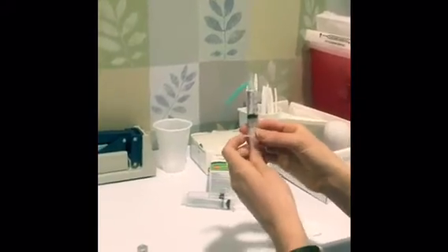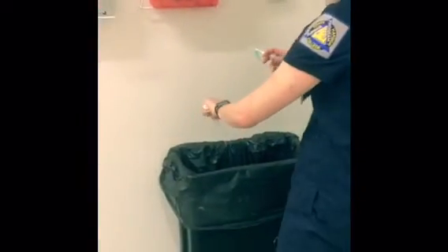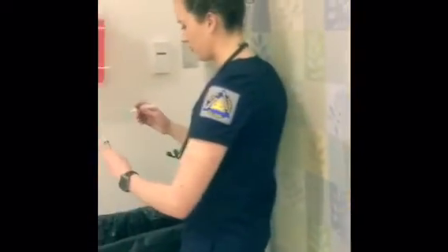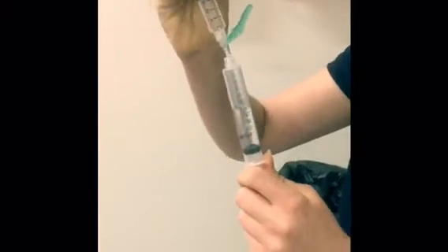So right there we have 4 milliliters. So that is 40 milligrams. Okay, so now I'm going to take this needle and I've got a new syringe. I'm just going to squirt out some of that into this garbage can so that I have room to put my furosemide in it. I'm just going to stick that in there.